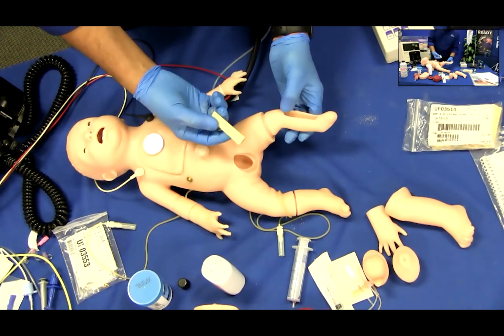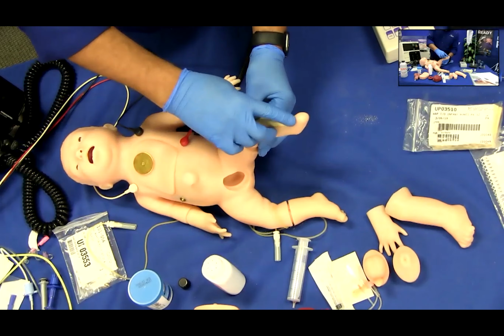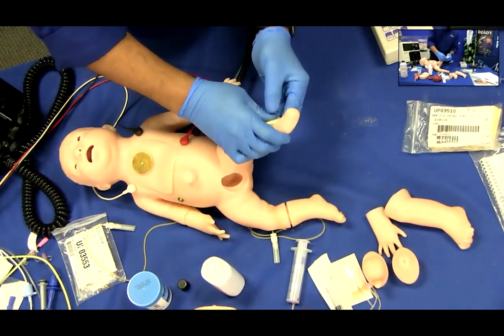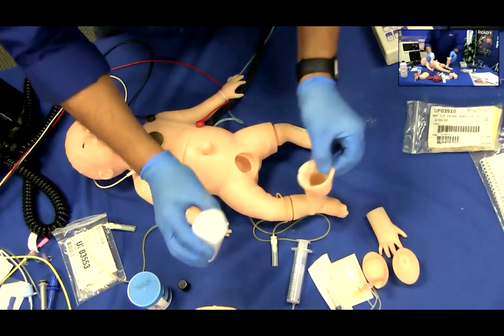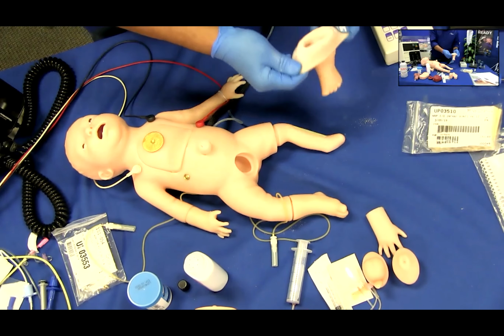To install the bone, correctly position the bone in the leg cavity. Then add a light dusting of baby powder on the inside of the skin and slide the skin over the leg.